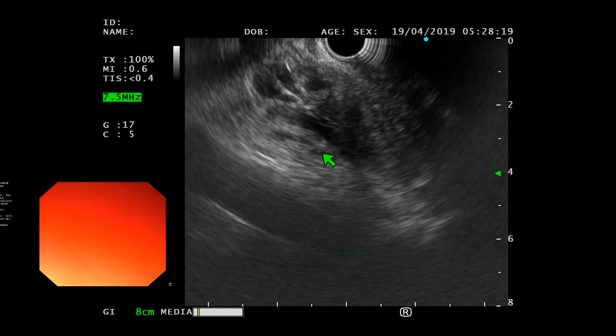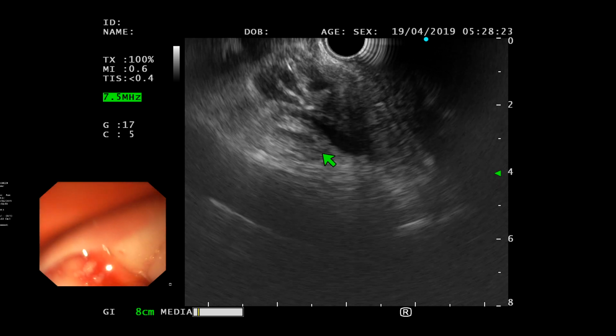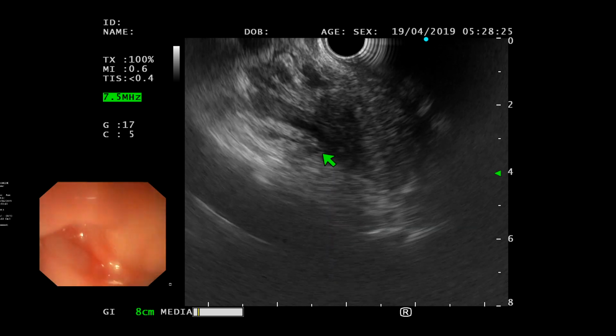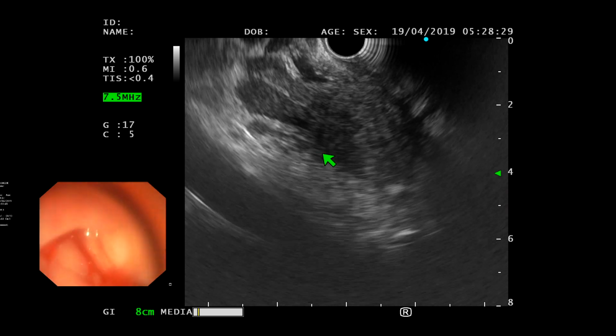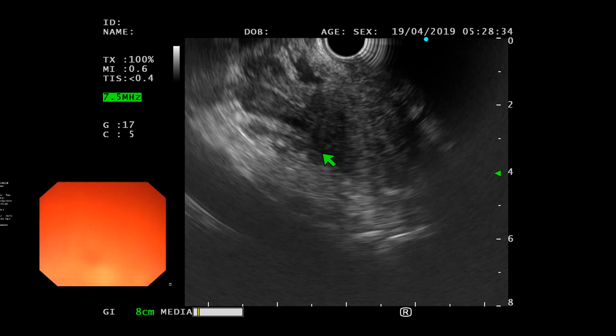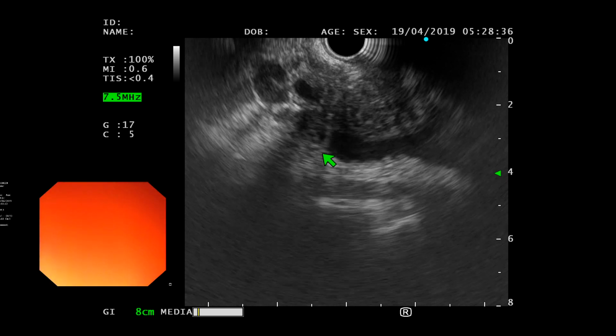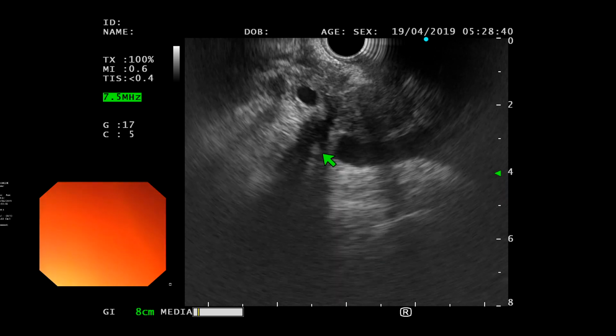No, not with EUS really, because the idea of EUS is to look at the pancreatic head. So the question from Om is, at this point, would you like to stretch the D2 and then go further? For ERCP, you do that because you have to release the obstruction, so you do need to go there.